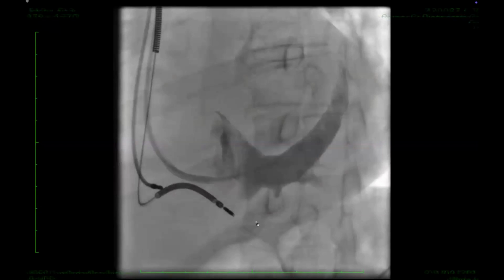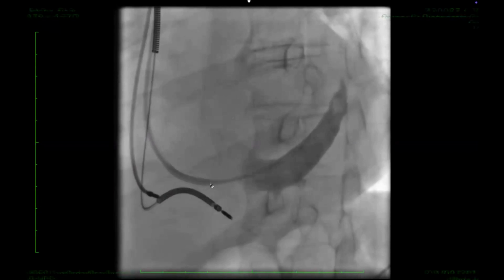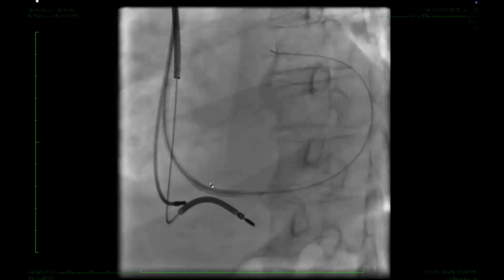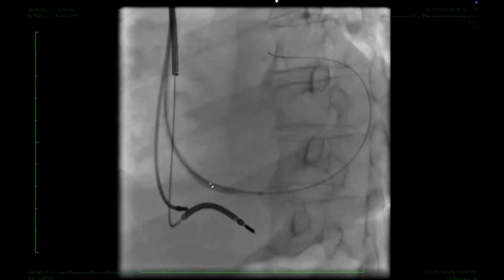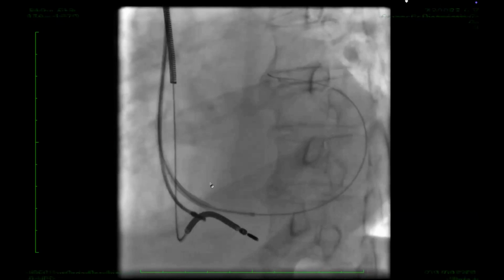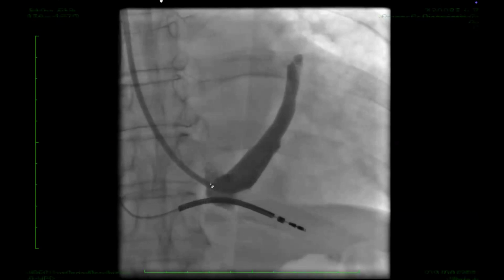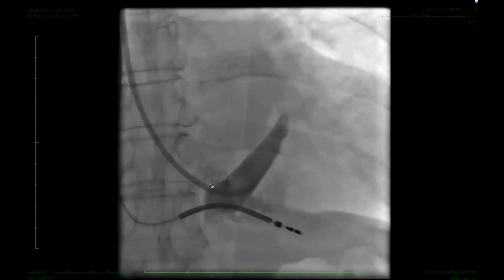We took the picture of the coronary sinus through the Amplatz catheter, not through the sheath, because the sheath ends over here. And we tried to interrogate the appropriate branch. This is a stiff wire now. It's called an extra stiff wire. You want to get one. And through that, I was able to now get my guide cath into the coronary sinus.